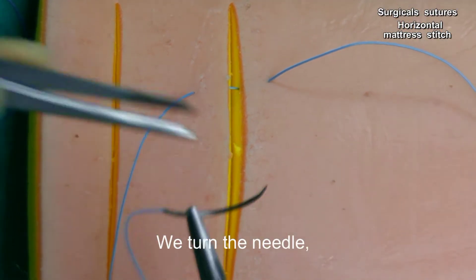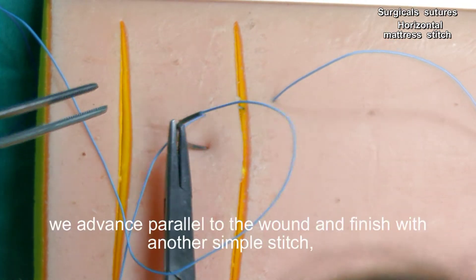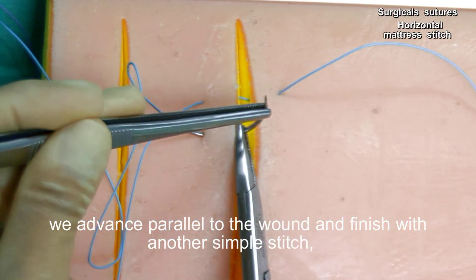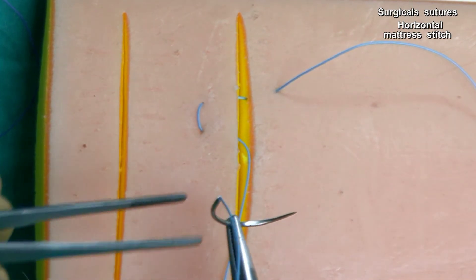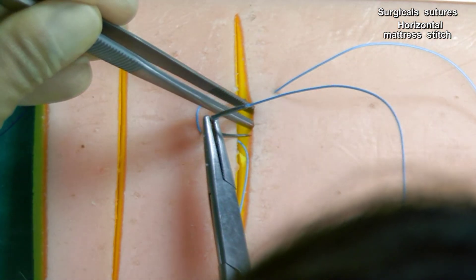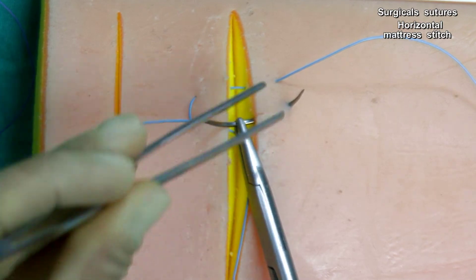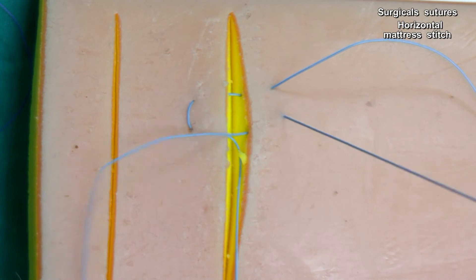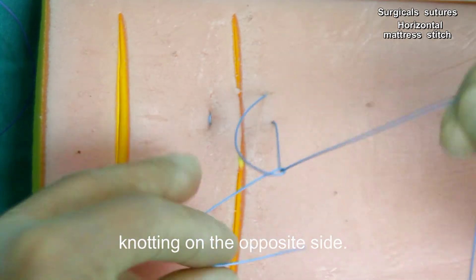We turn the needle, but instead of inserting the needle close to the edge, we advance parallel to the wound and finish with another simple stitch, knotting on the opposite side.